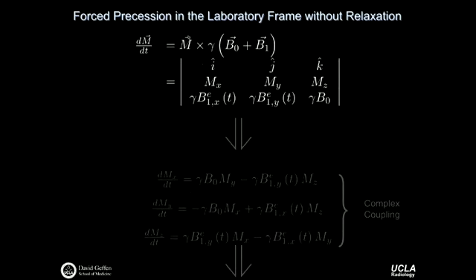When we look at taking the cross product of these two terms, you'll remember we write our unit vectors across the top. We write our bulk magnetization vector components along the middle, and then we just spread out our B field across the bottom. Our B0 field only has a K direction, so it only ends up in this far right-hand term, if you will. And our B1 field only has I and J components to it, right? It was this B1 envelope function plus an I hat term and a J hat term. And so we just put the I hat term here in the I hat column and the J hat term here in the J hat column.